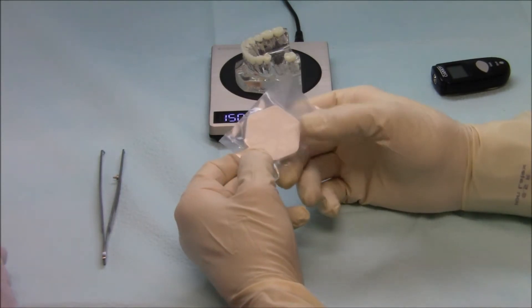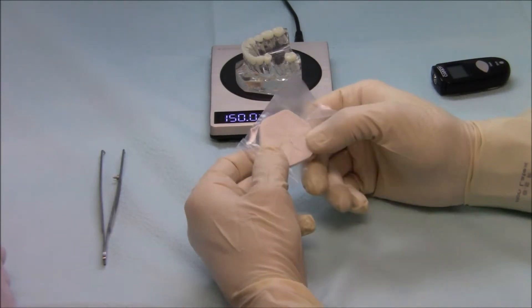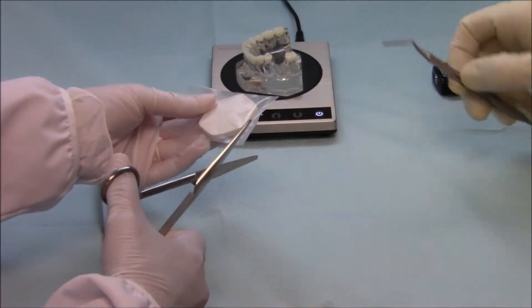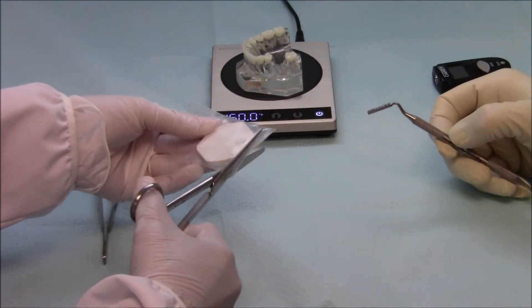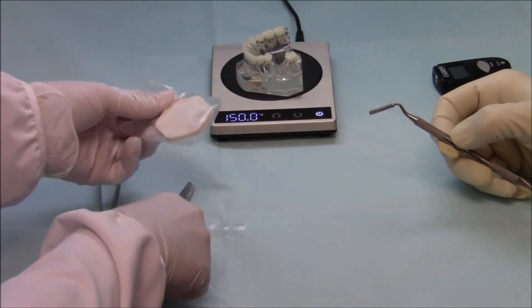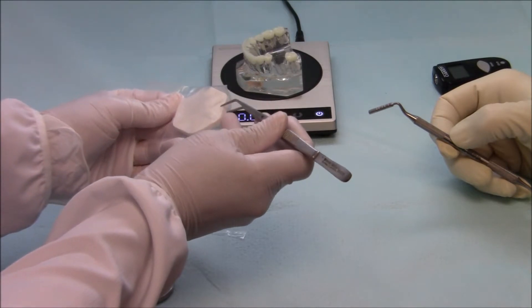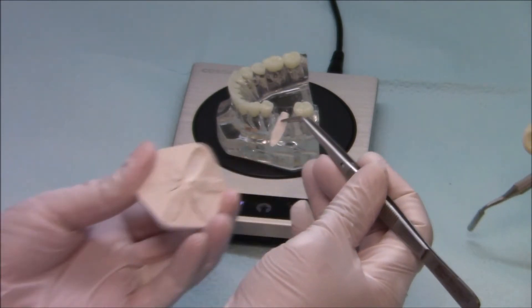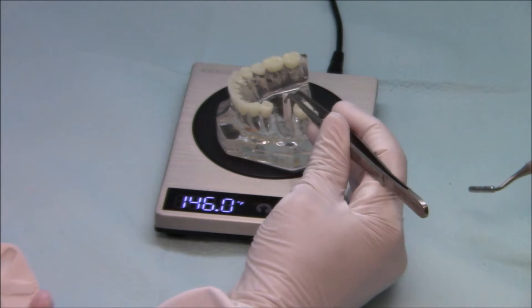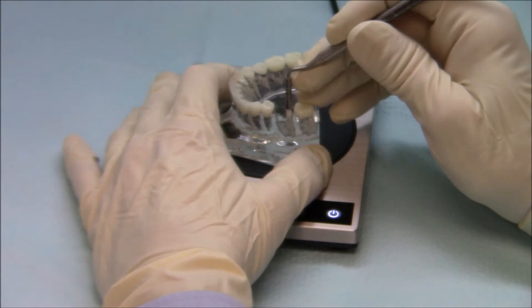The tray is flexed while in the bag to loosen the petals from the tray and to prevent dropping the material. The bag is opened and the tray is placed on the operating table. The petals have a pointed end and a blunt end. Pick up the petal with cotton pliers at the blunt end and place it into the extraction socket.